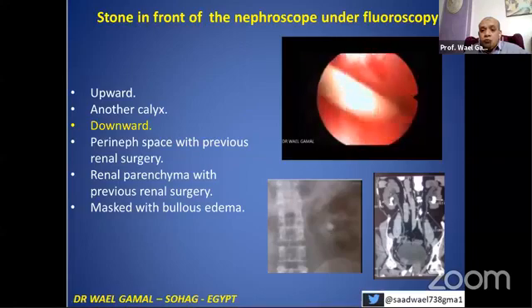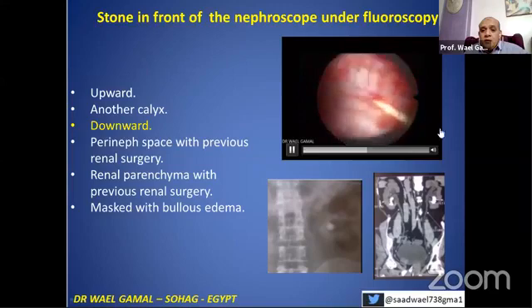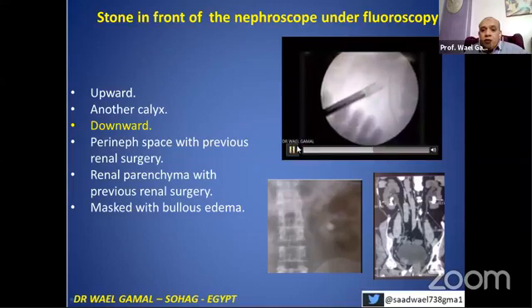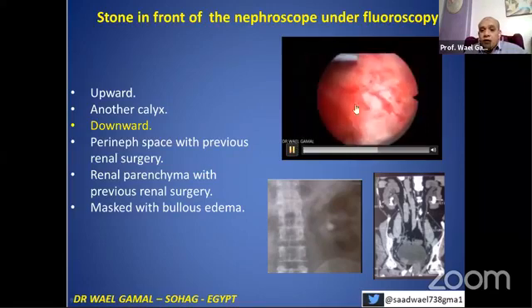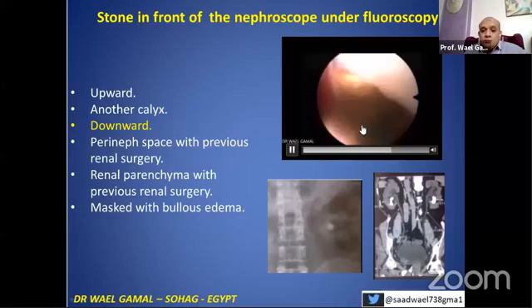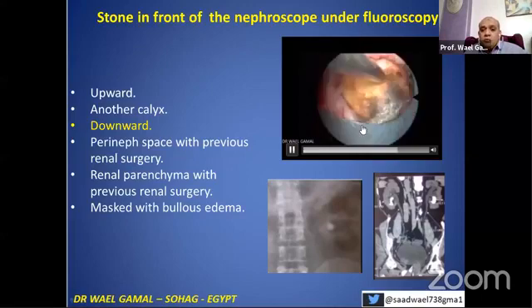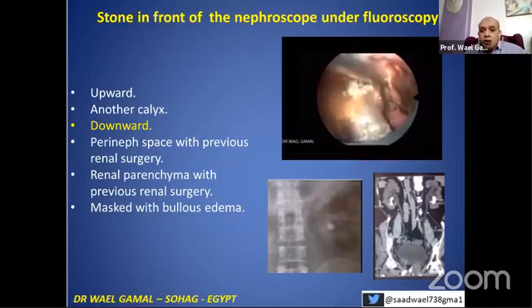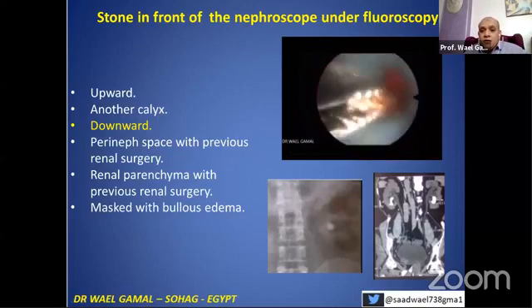What happened? Under fluoroscopy, we find a stone — it looks like the same stone. I did nothing? No — the branches of the stone in the lower calyx are anterior and posterior. You have to turn your nephroscope looking downward for the posterior branch, the posterior calyx of the lower calyx. This is the anterior branch of the lower calyx.